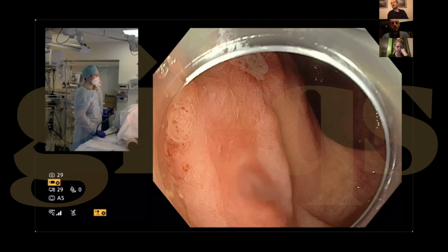Yeah, so I would like to continue this conversation by ignoring all the ulcerations. The ulcerations are from previous polypectomies, performed somewhat in haste, maybe by the person referring, but of course, maybe you didn't see this other lesion at the same time. It's really quite difficult and quite subtle. So of course, these things happen, like you can't go back and be critical. So there are some polypectomies that happened here a couple of weeks before. So the ulcerations are not part of the lesion we're discussing.